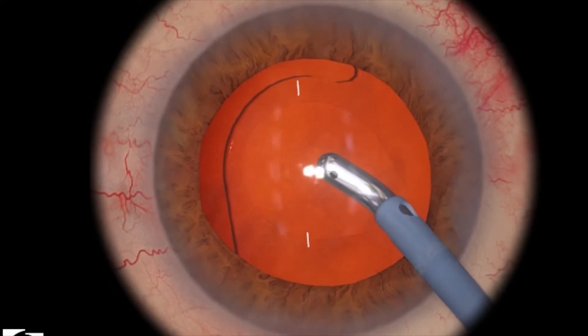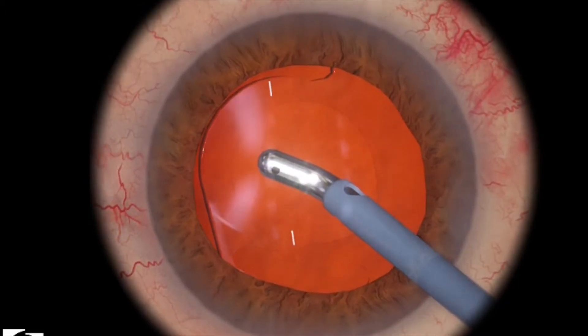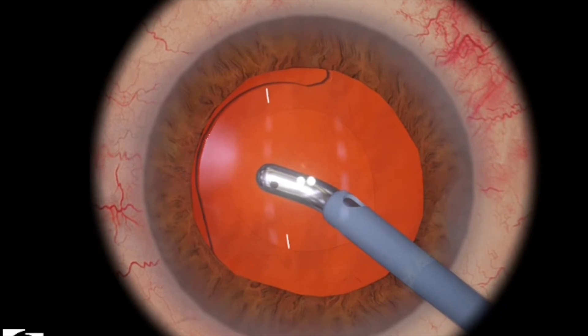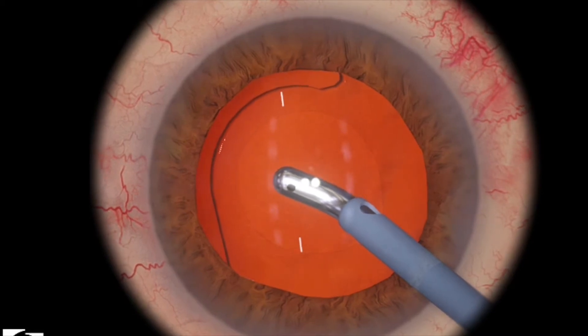Just use this very slow rock and roll technique. Try to get some of the viscoelastic out. Hold the lens there basically with your IA tip, and then aspirate slowly. Here I'm getting most of the viscoelastic out.